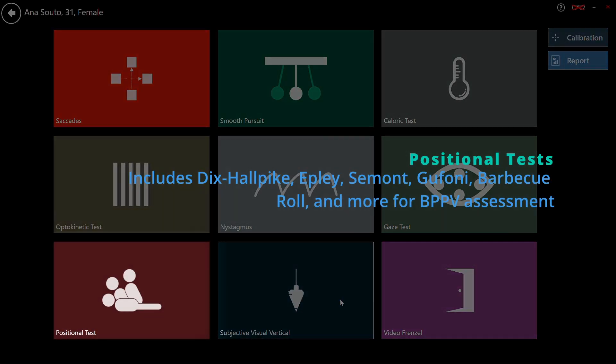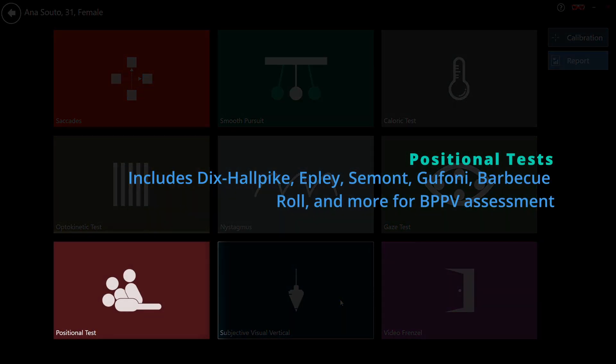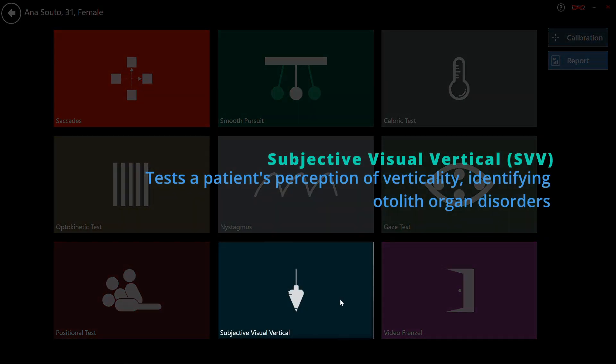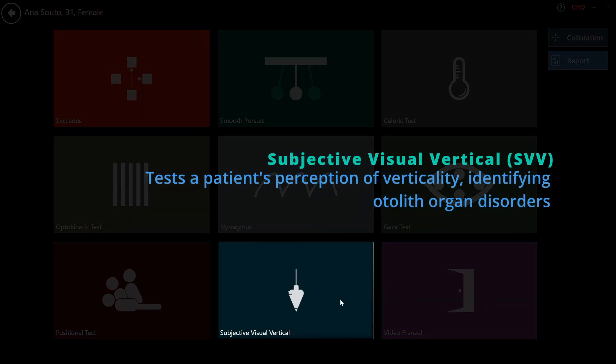Positional tests support standardized positioning protocols including Dix-Hallpike, Semont and barbecue roll. Subjective visual vertical SVV.